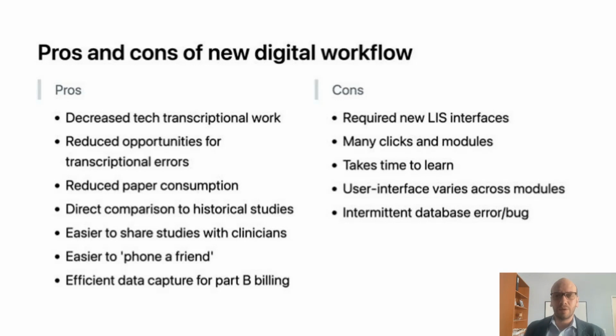There still are many clicks and many modules for the pathologist. This certainly slowed us down compared to the prior process, at least from the pathologist perspective. But everyone's become a lot more efficient with a little bit of training. So this issue has lessened over time. There is a learning curve, and the onboarding process takes a little more time for pathologists.